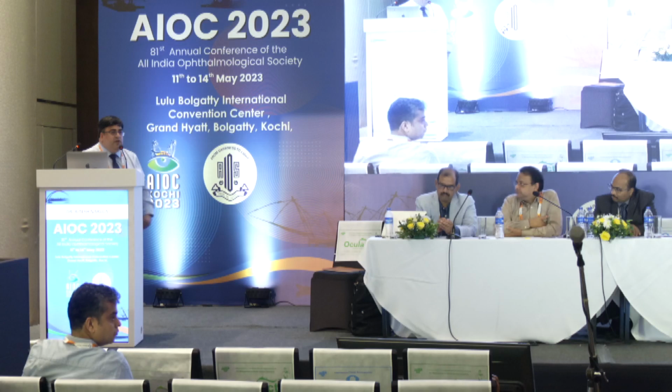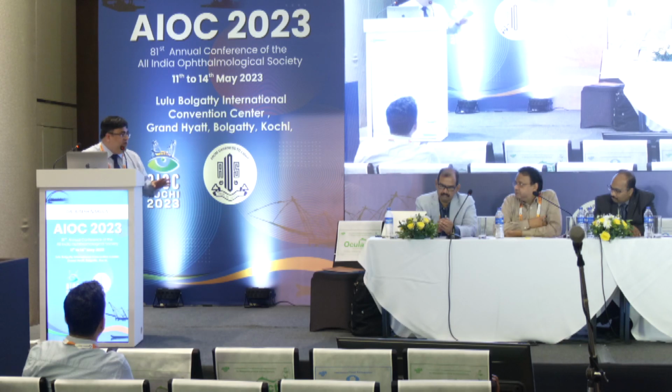So look at what you need this machine for. Do you want a standalone machine where you are not interested in having an FFA, ICG, nothing of that sort? You don't want a fundus camera. Then you can look at a purely OCT angio machine like an RTView, which is a little cheaper and gives you a decent OCT angio and a fast scan.